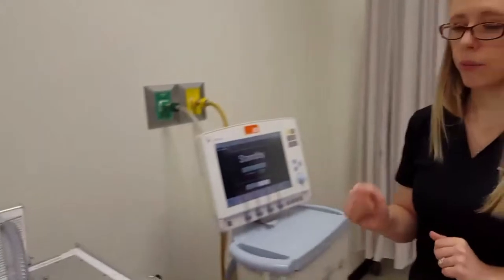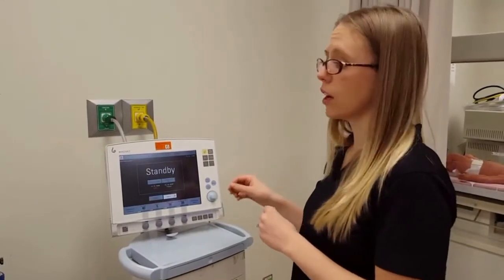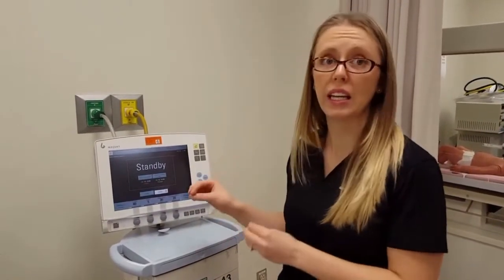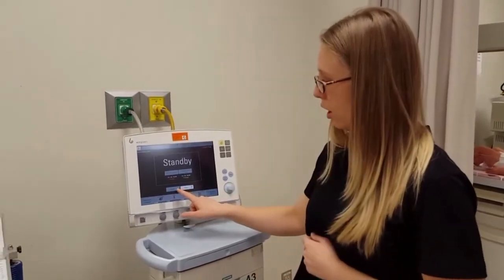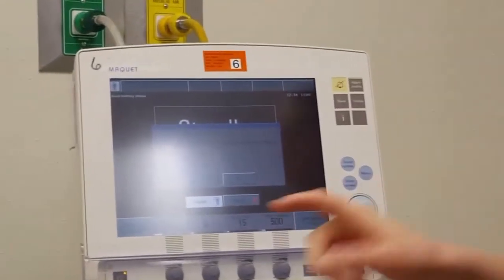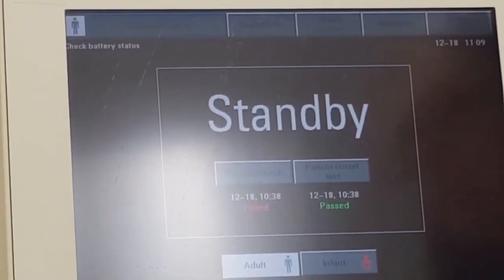Okay. From there, we need to get our ventilator ready. We know what our patient is like now, so we can adjust our ventilator accordingly. We never want to put a ventilator onto a patient before we adjust our ventilator to what we need it to be. So this is going to be an adult patient, so we can change our ventilator to adult. It's going to say, are you sure you want to accept the compressible volume changes? You're going to click yes. There's a difference between adult and infant circuits. We just want to make sure we have the correct circuit.